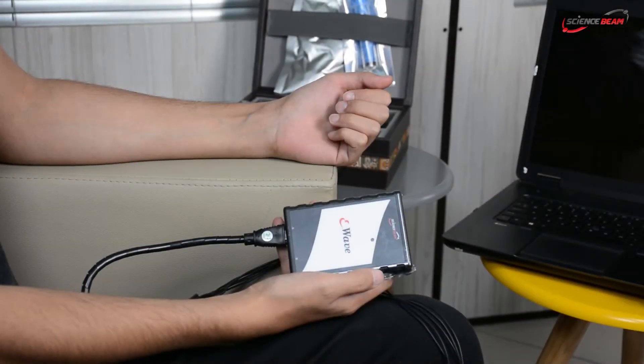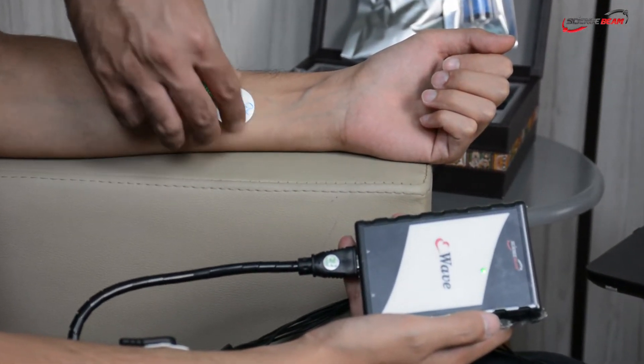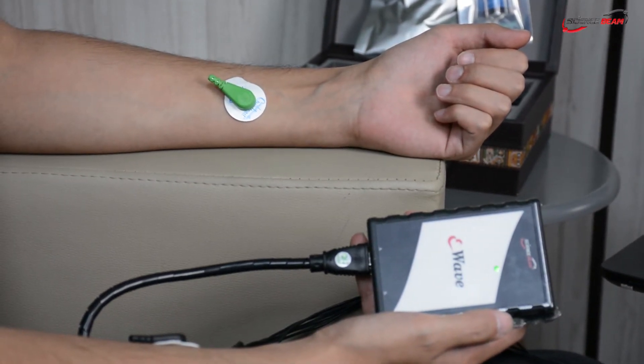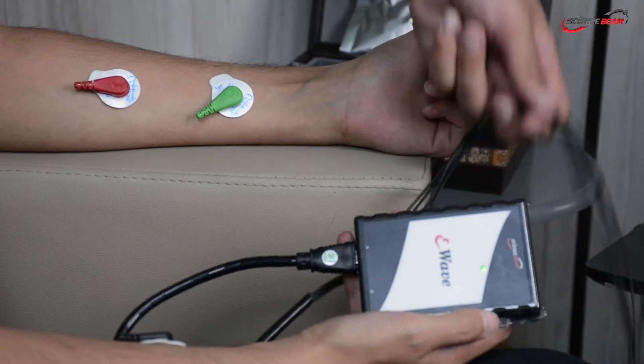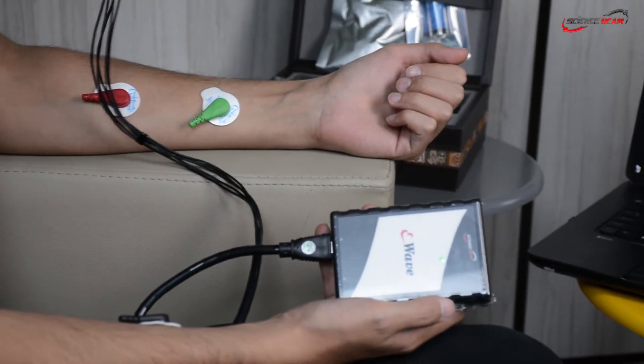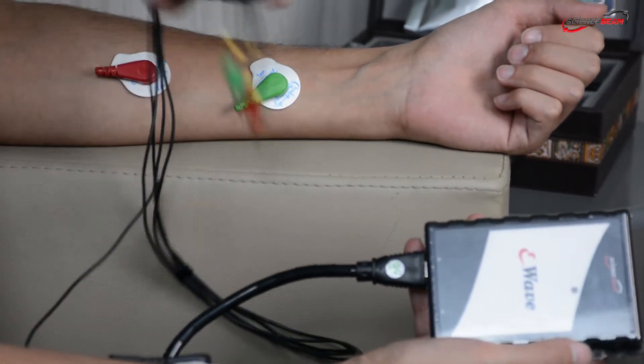In this video, we're going to record EEG and EMG signals using the eWave device. During a biofeedback session, a therapist attaches surface sensors to different parts of your body. These sensors might be used to monitor your muscle tension.